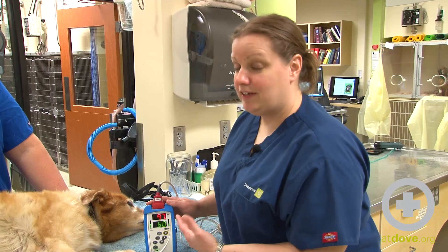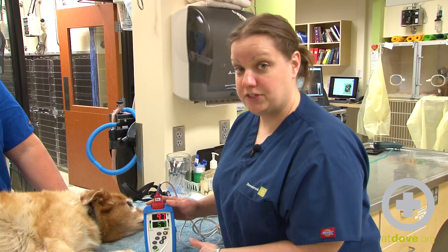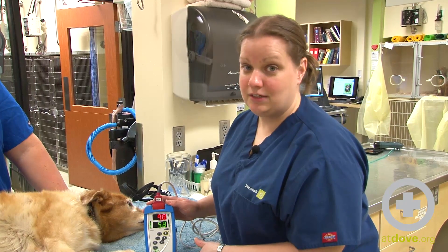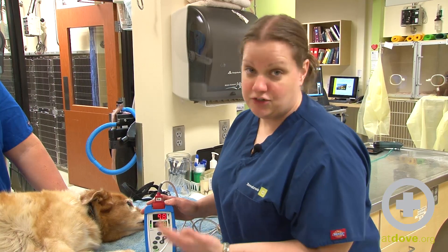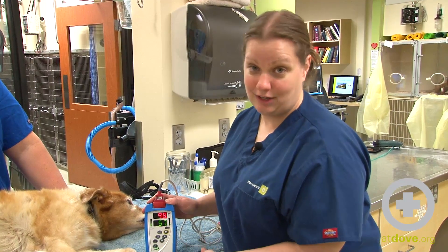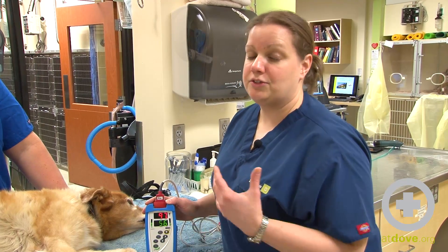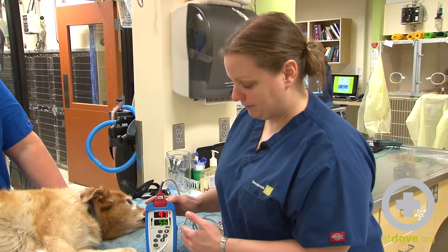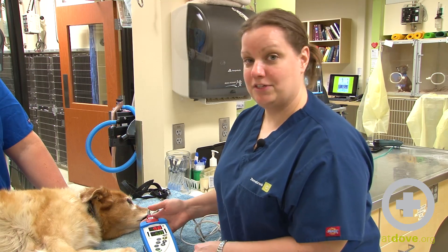It's good to leave it on there and let it read for, if you can, 20 or 30 seconds, just to make sure that number stays between 96 and 98 percent. When I record this I can write either a range — 96 to 98 percent — or whatever number it stays on the longest. It's also a great idea to write down where I got the Pulse Ox so the next technician knows. Then we will perform this as often as needed to check how well our patient is oxygenating. And that is how we get a Pulse Ox.